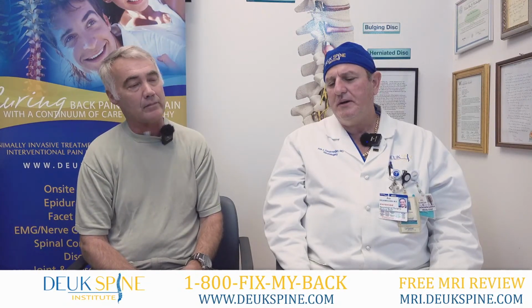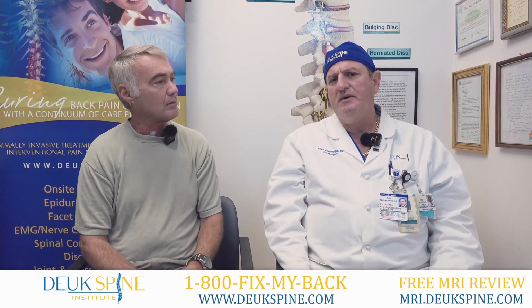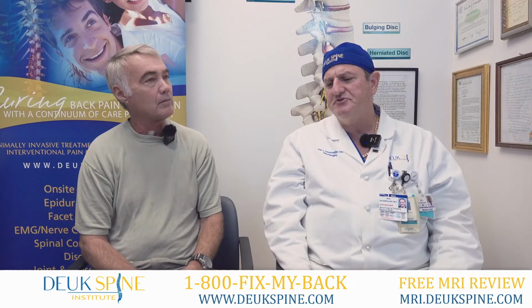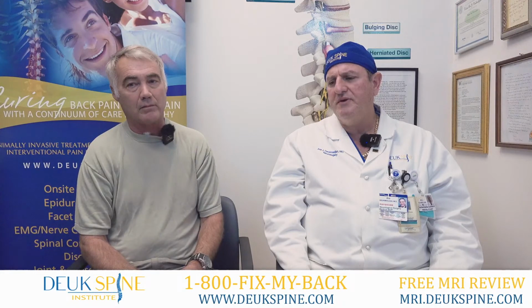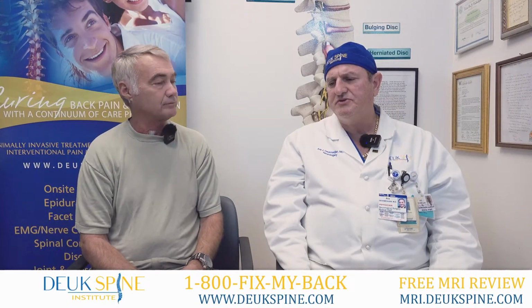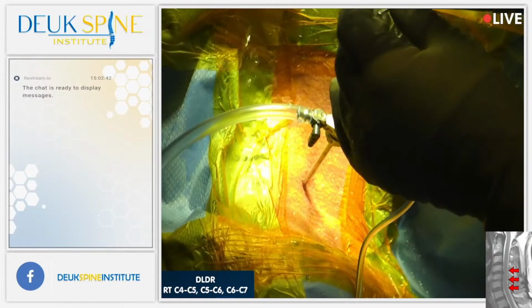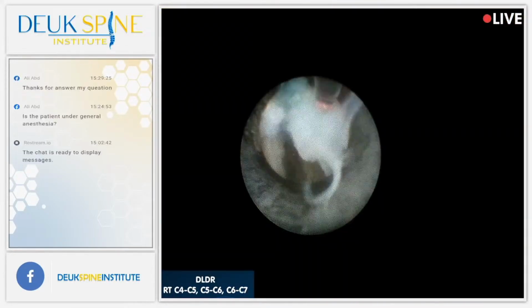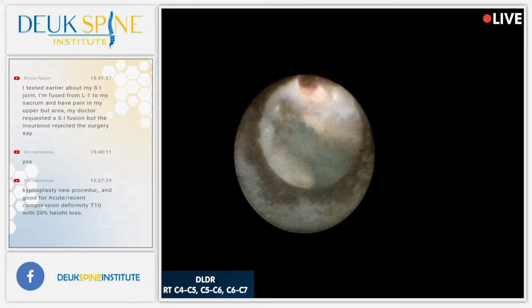But you broke it up into 2 procedures, and we get people all the time asking us, can I come there and get my neck and my back fixed? Yes, you can. We'll probably do it on separate days. So you got 3 discs repaired yesterday. You can actually see right here in this video footage how small the incision is, tiny. I was in there endoscopically using a laser to clean out the tear and remove the small herniations.